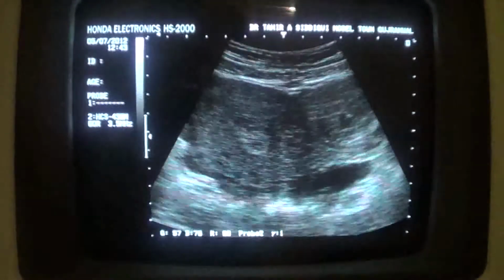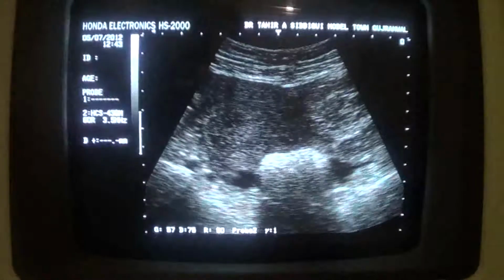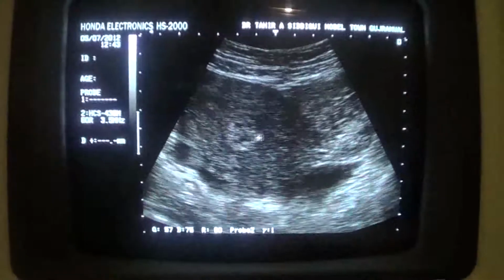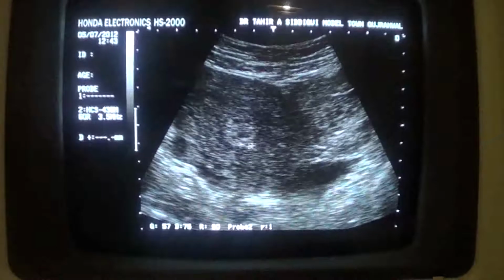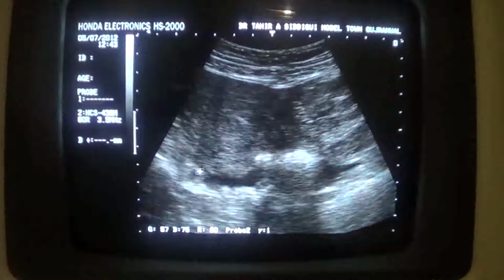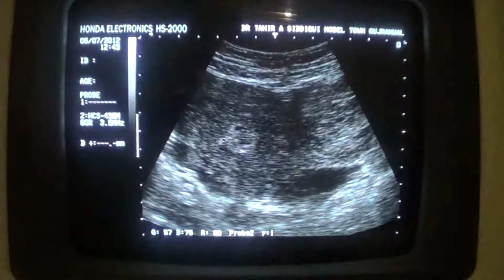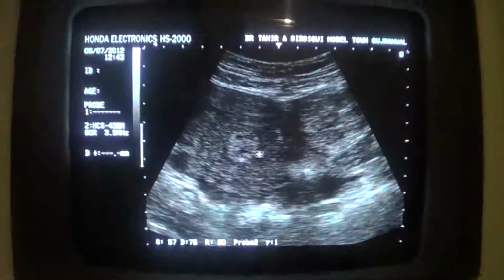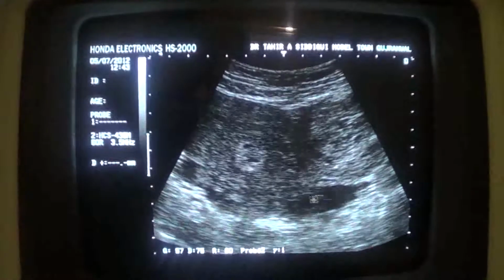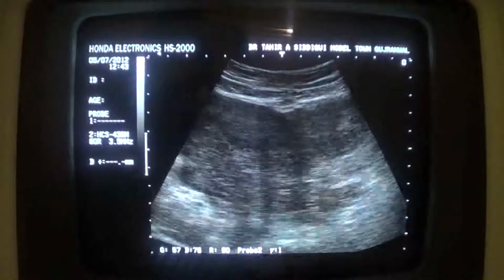And you can see a lot of fluid posterior to the uterus with bowels. This is the bowel segment with dirty shadow. This is the fluid. This is the endometrial canal. See the characteristic appearance post D&C. This is collection of blood post D&C. Now this is all fluid, and the fluid contains low level echoes in transverse section.